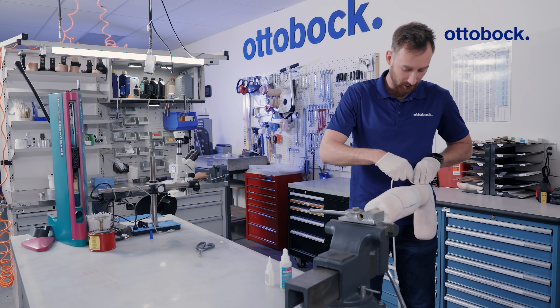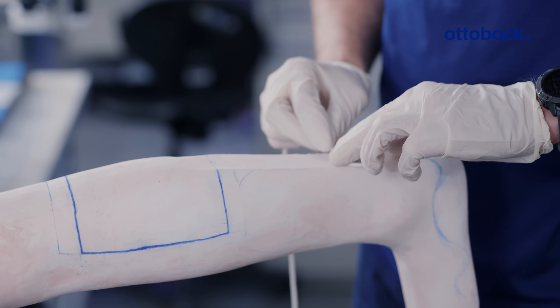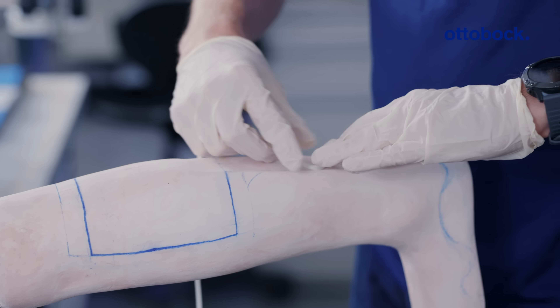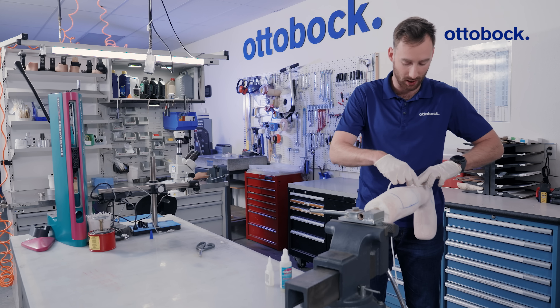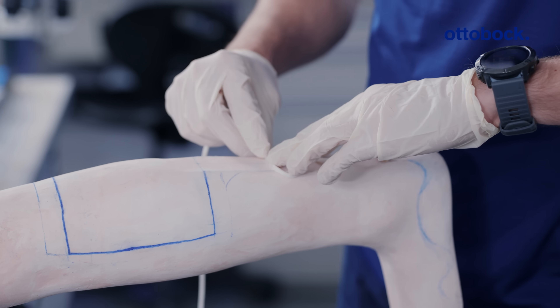I will now lay my material in the shape that I want it to have. In this instance, I'm going to make a zigzag shape, and this functionally increases the surface area on the backside of the device to make it stronger for the user.